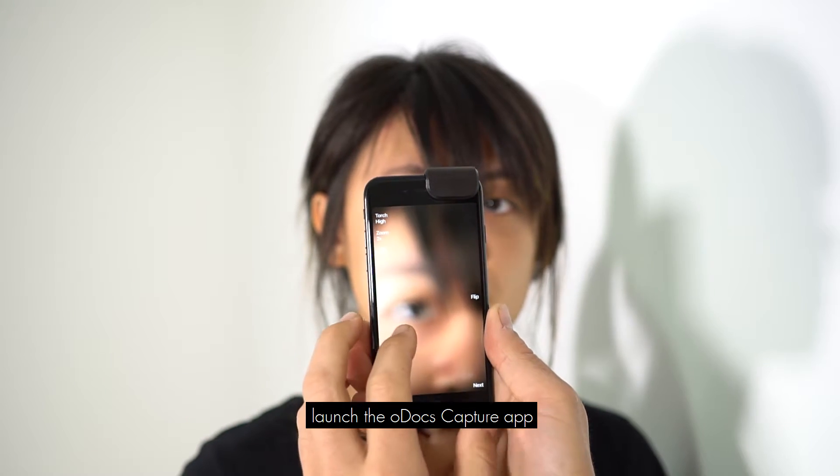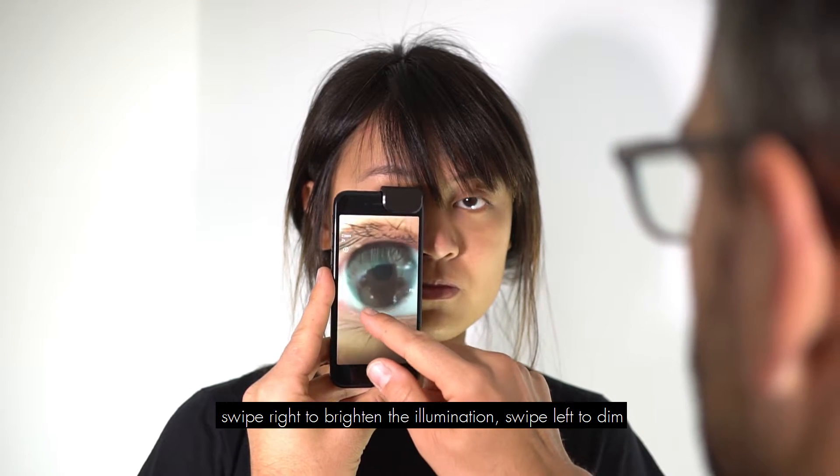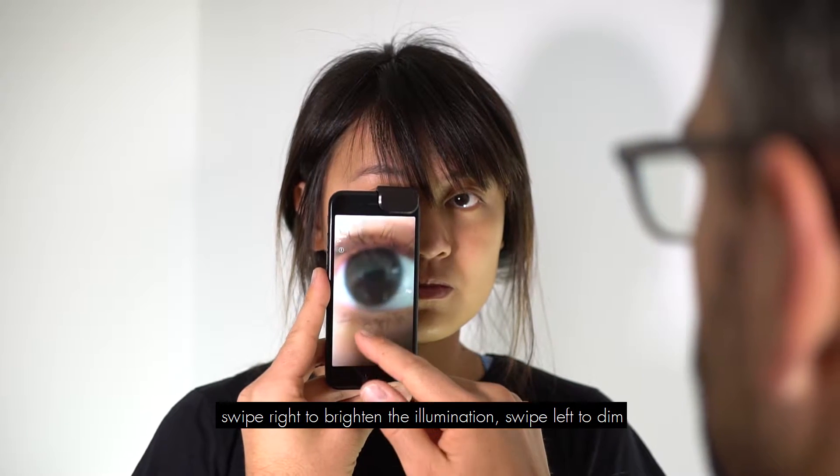Launch the O-Docs Capture app. Swipe right to brighten the illumination, and swipe left to dim.